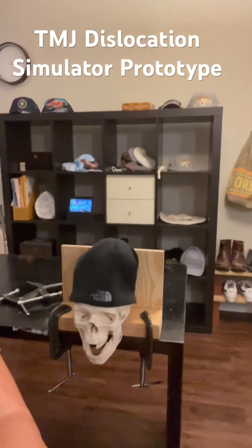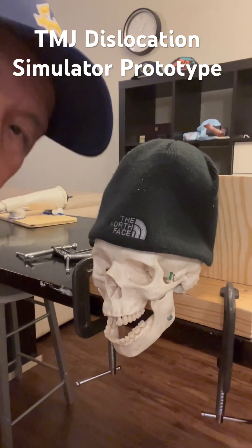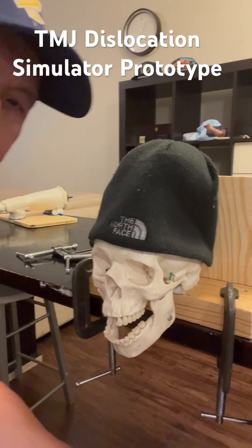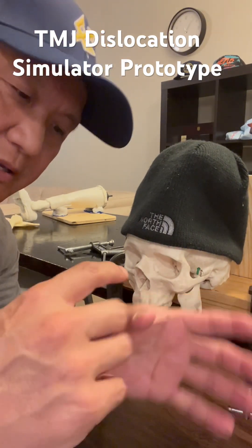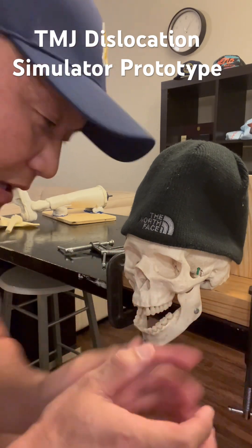So now, the usual technique you see on YouTube is the patient sitting down on a chair or stretcher. Then you basically put guards or some kind of protective material on your thumb.